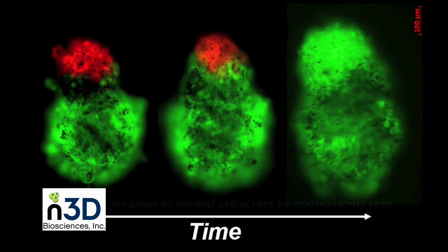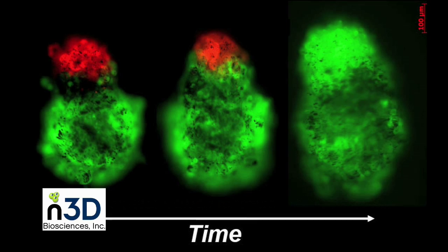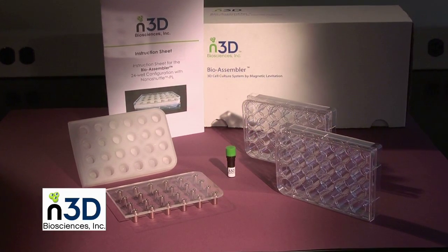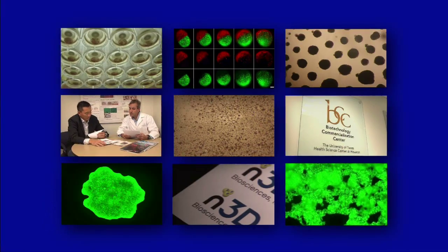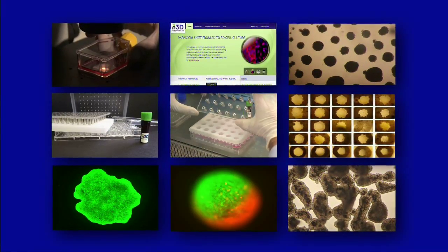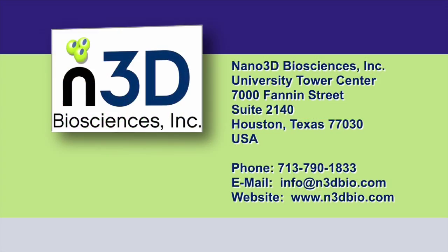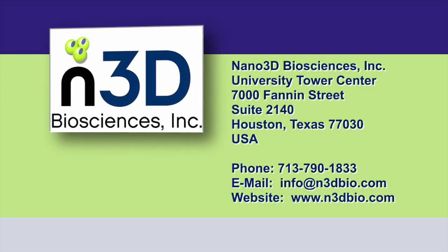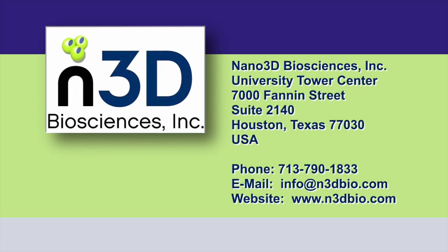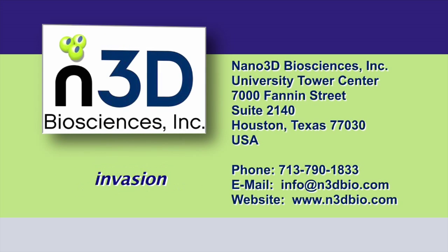For the most delicate 3D structures that float at the media surface, media may be exchanged very carefully without placing the magnet underneath. Guiding cells to the bottom can also be useful for high-resolution imaging, such as confocal or deconvolution microscopy. Co-culturing different cell types is easy with the BioAssembler. By following this simple procedure, your lab is now ready to conduct research on a lifelike three-dimensional grouping of cells, with only a few minutes added to your culturing and preparation time. Contact Nano 3D Biosciences today for more information. Future applications being developed include label-free assays, co-culturing, magnetic manipulation, and invasion.